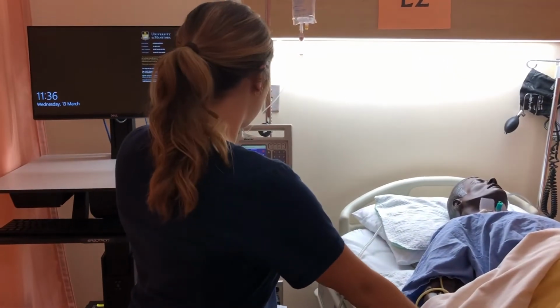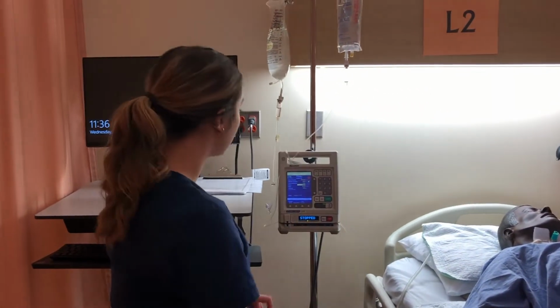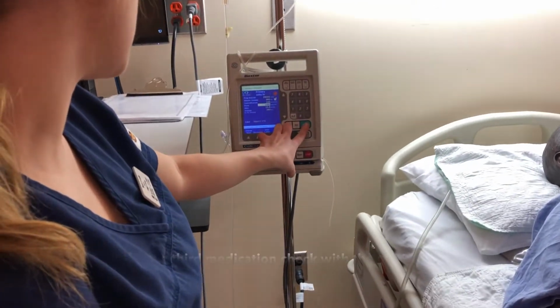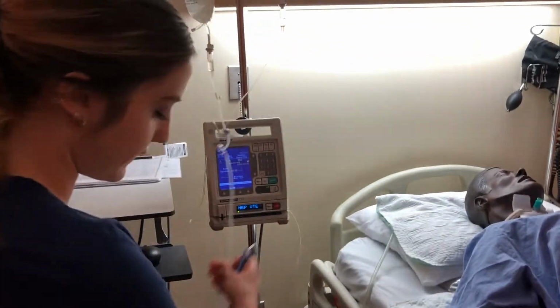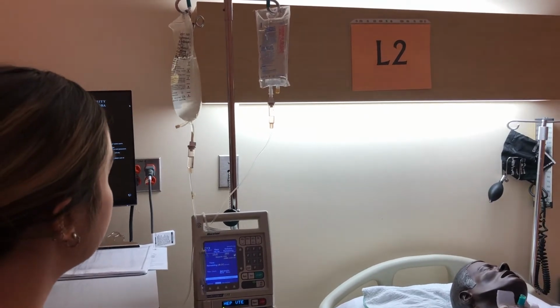I'm also knowing she has the right to refuse the medication if she wishes, but she doesn't want to. So I've checked my rights, I've primed my lines. I'm going to start my infusion now. Start. Going to open my lines and make sure I'm watching for 3 drops, and this is going at the correct drip rate.